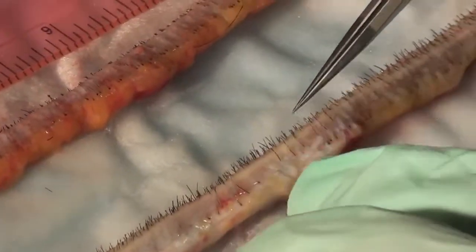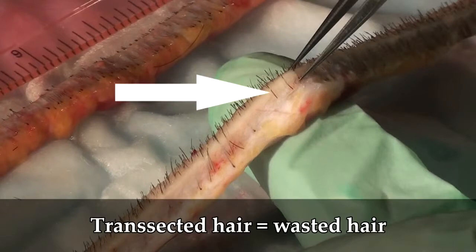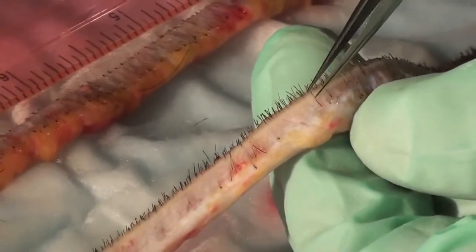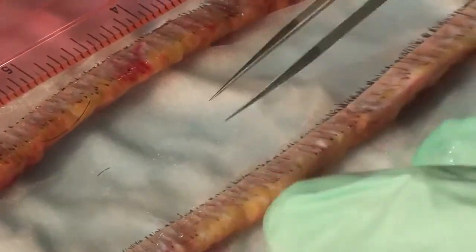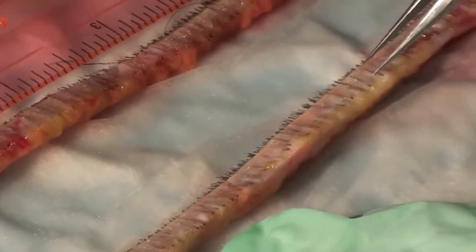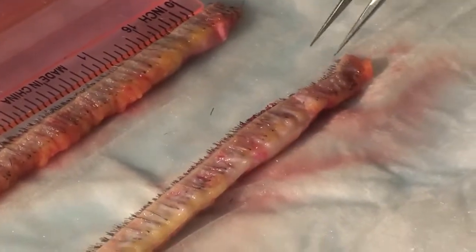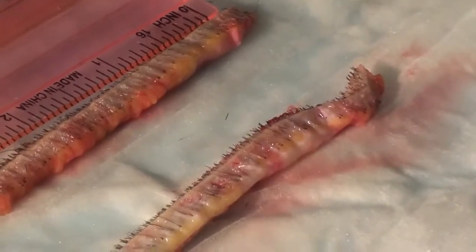This is what a transected hair looks like right here. So where you see these two cut hairs where they don't have a bulb, that's a transected follicle, okay? So those basically are no good. So we lost 2 hairs there. But outside of that, let's look at the rest of the strip. The rest of the strip is nice and solid the whole way. So on this whole scar, you might only have lost maybe a few hairs in the harvesting process, which is absolutely terrific. Now you can take a look at this other strip here.